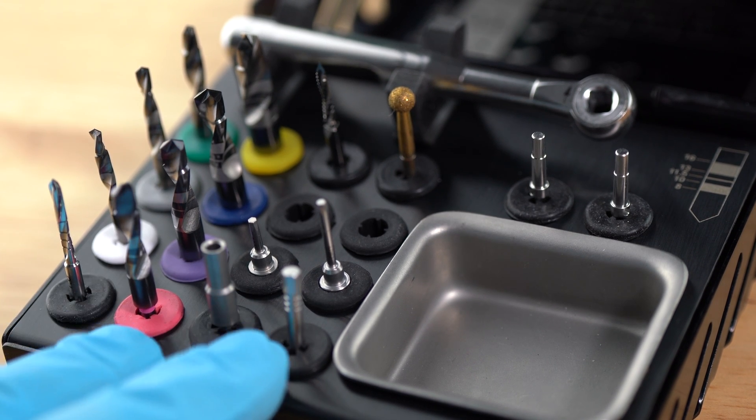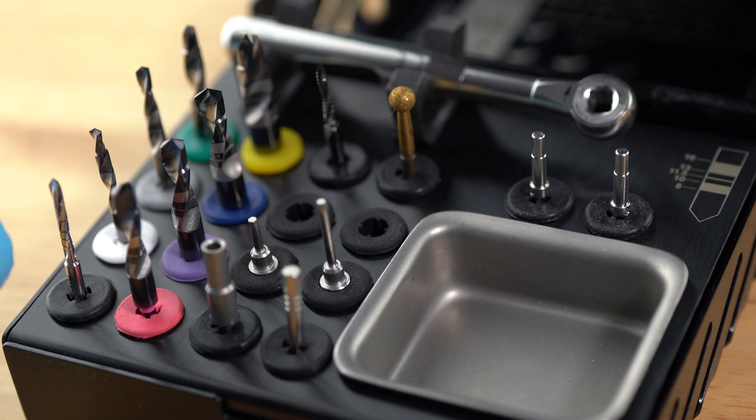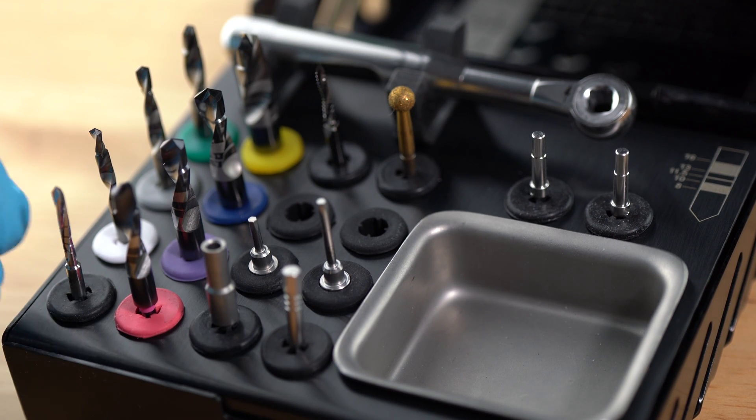This is your Implant Club kit, and with it you have a couple of different options for your starting drill. You have your basic Lance Pilot drill, your Lindemann drill, and also a round burr. Let's take a look at a couple of them.